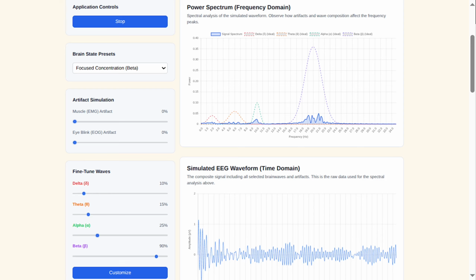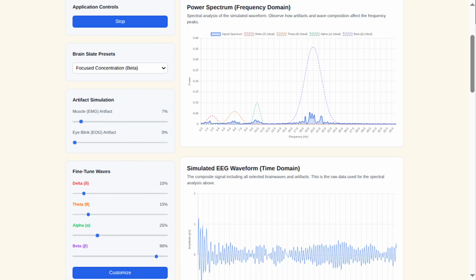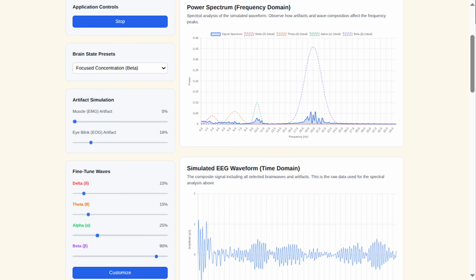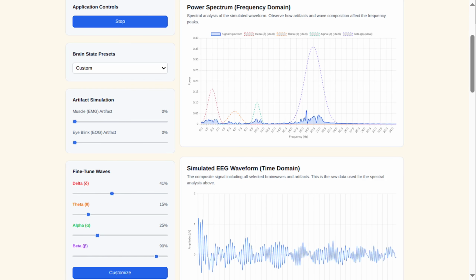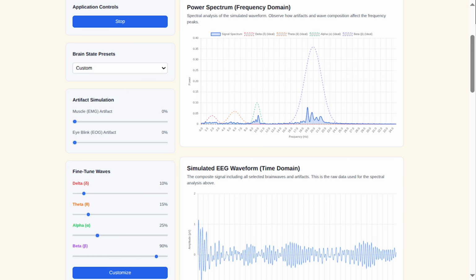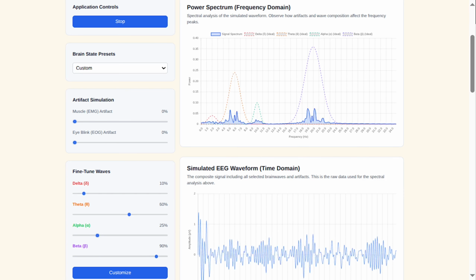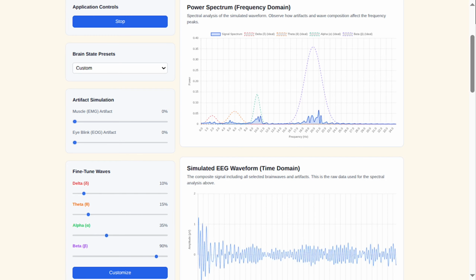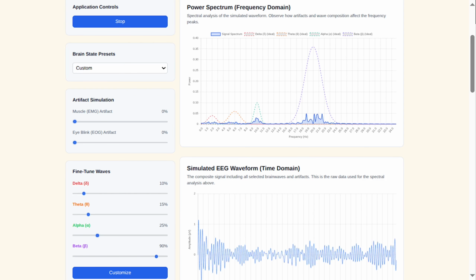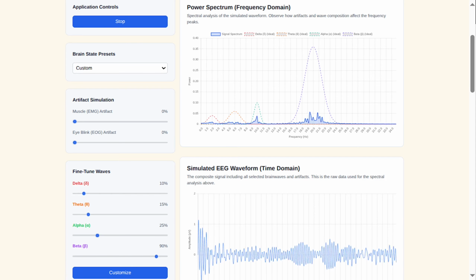How about subscalp? Yes, subscalp electrodes are placed just beneath the scalp, deeper than subdermal, but not penetrating the skull. They offer a stronger signal-to-noise ratio and are less invasive than intracranial electrodes, making them useful for certain monitoring applications. So would it be called subscalp or periscalp? It's typically called subscalp. Periscalp is rarely used. Subscalp is the more common term for electrodes placed under the scalp but above the skull.